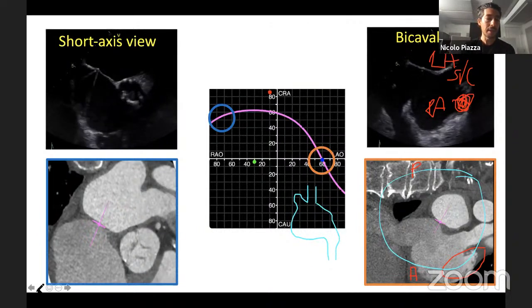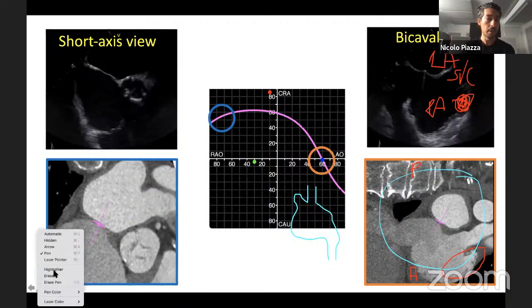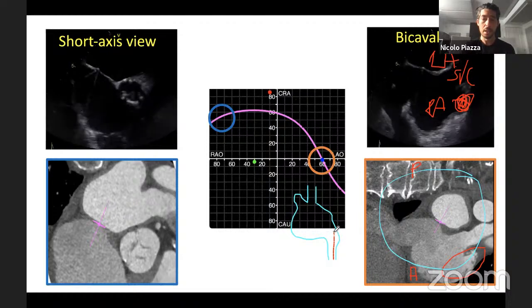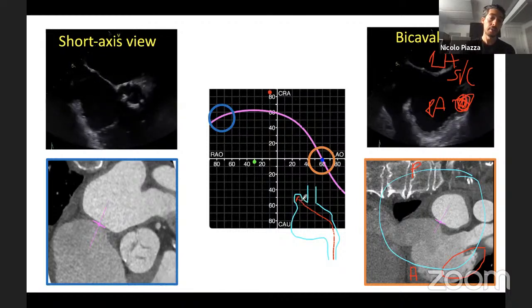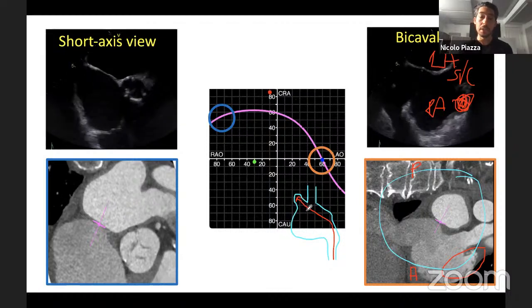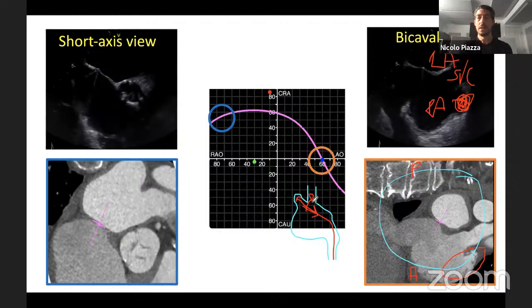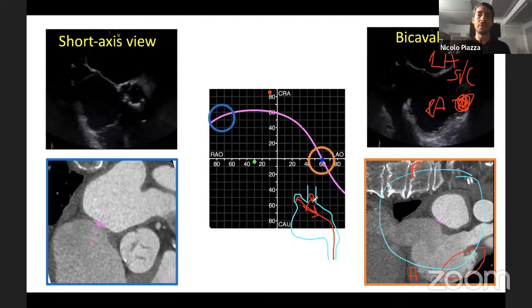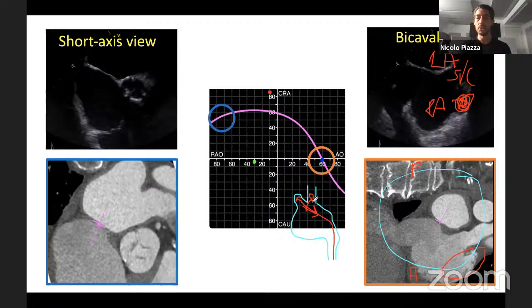And so what is happening in those cases is that your wire comes up, it gets deflected by the atrial septum, and it goes straight up into the right atrial appendage. That's where your wire is buckling. So what you need to do is you need to pull back, and you need to go more posterior, because your SVC is more posterior, yet it's a relatively anterior structure, but it's more posterior than your right atrial appendage.